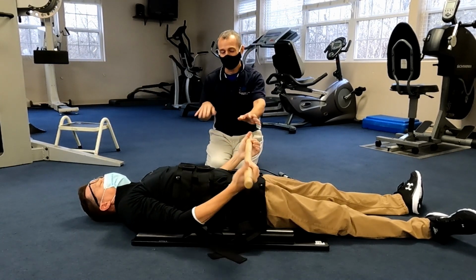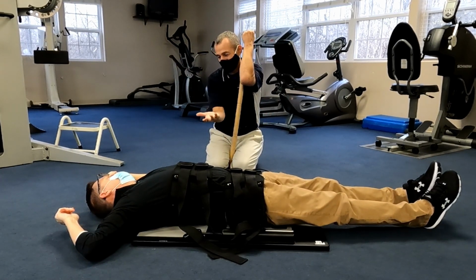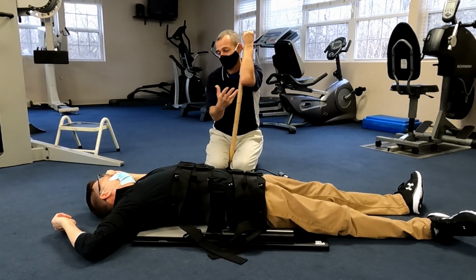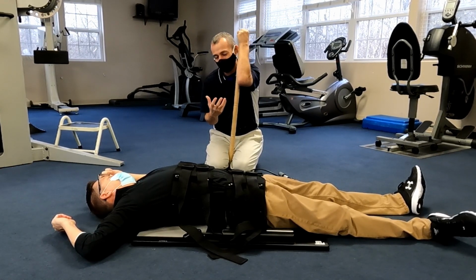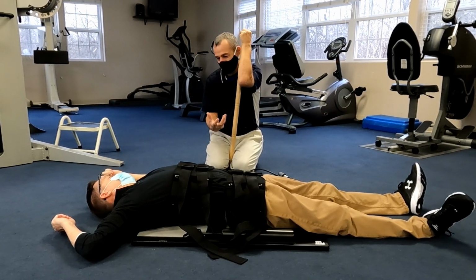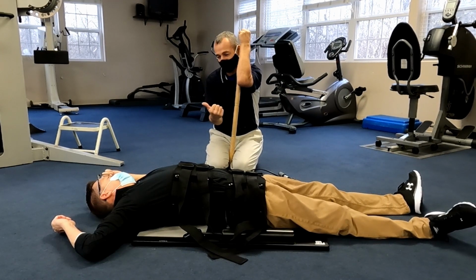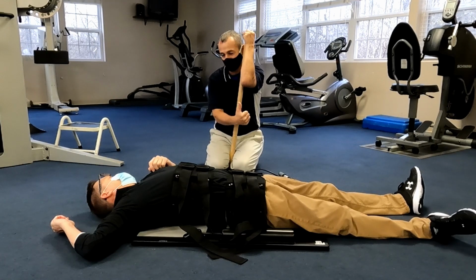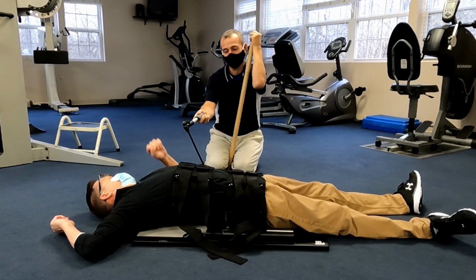Then of course you could add, take a break, so you could add moist heat, right? Like we talked about putting little pads and stuff underneath there. You could add an ice pack if you respond better to ice versus heat. You could add a TENS unit with the ice. You could add a ridiculous number of things to increase the, I'm gonna say the power of the experience, improve the placebo, which absolutely has a physiologic impact with minimum risk. And then you add the exercise into it. So now, go ahead and deflate it.